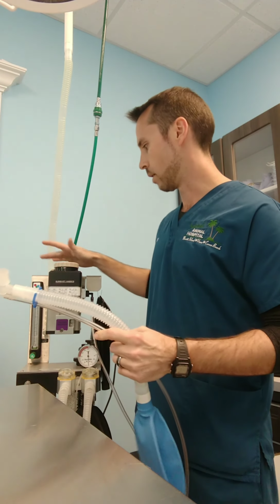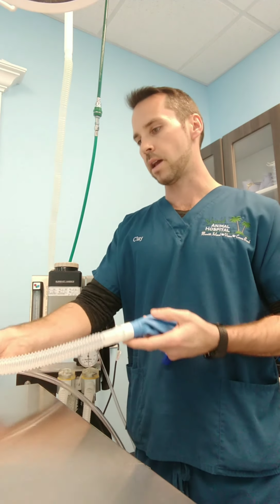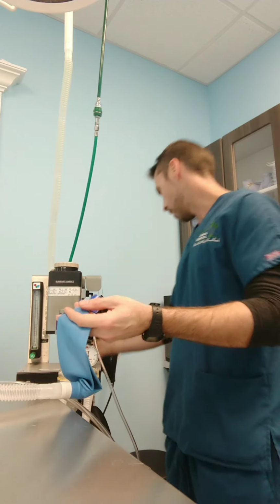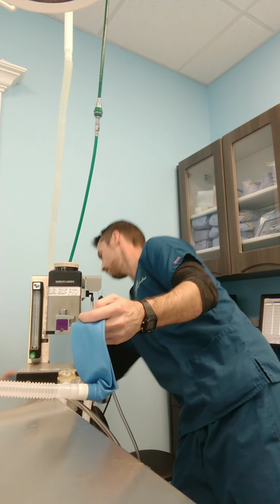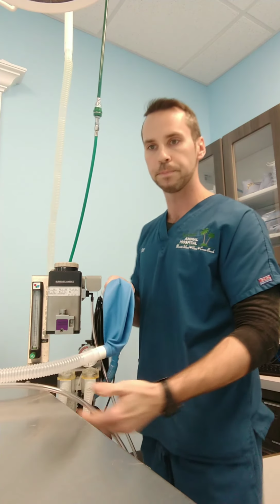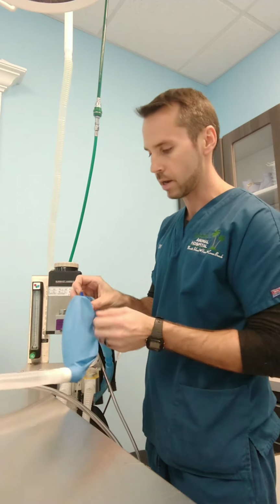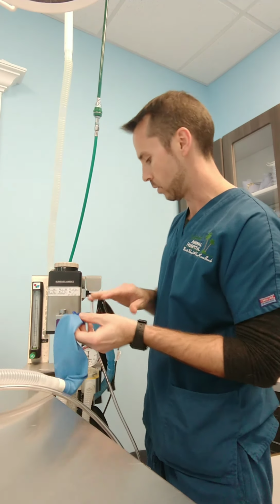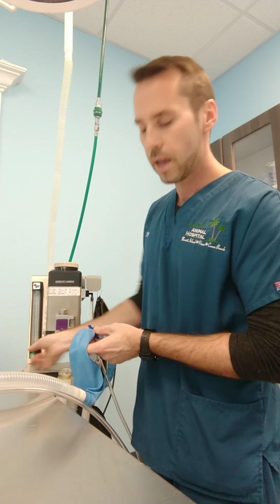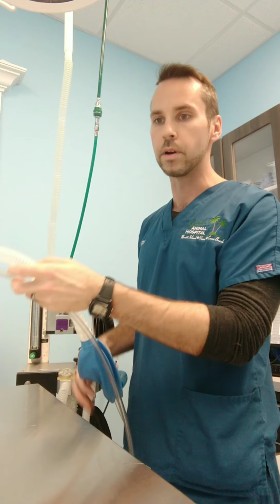They breathe the oxygen mixed with the isoflurane through this tube, and then they exhale carbon dioxide, which goes through the reservoir bag, which hooks directly to our scavenger system. So there is kind of a little pop-off valve inside here that you can turn on and off, similar to the pop-off valve in the rebreathing system. And then this is the reservoir bag for the non-rebreather.